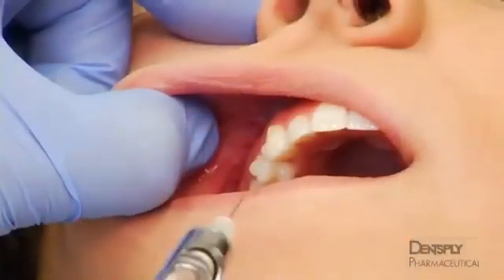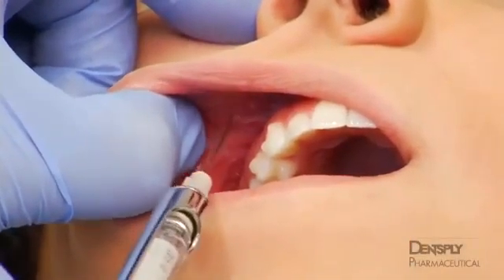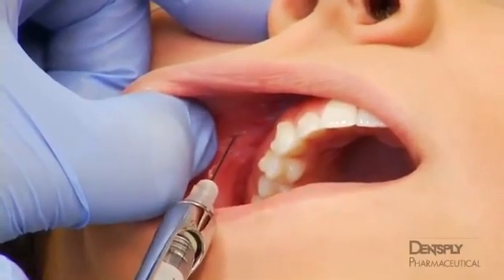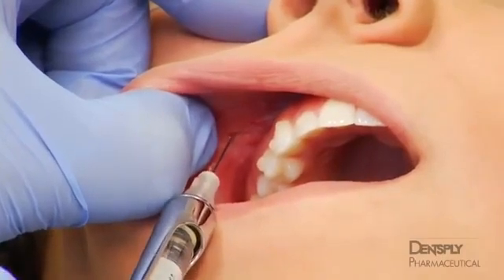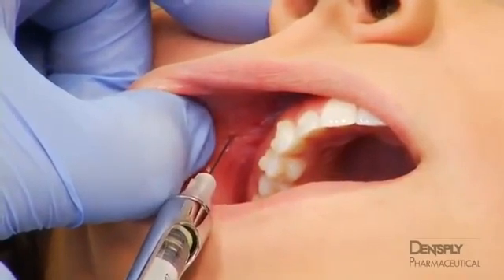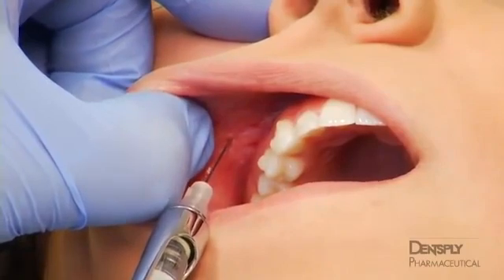The needle is then inserted vertically about 5 millimeters lateral to the second premolar and parallel to the long axis of the tooth with the bevel of the needle towards the face. The orientation of the needle as seen from the front of the patient should mirror a vertical line, defined by the medial aspect of the pupil and the infraorbital foramen.